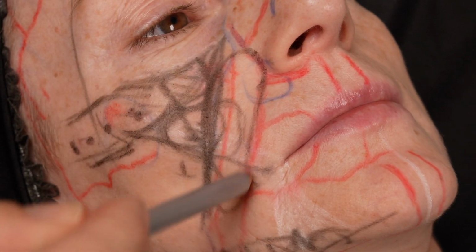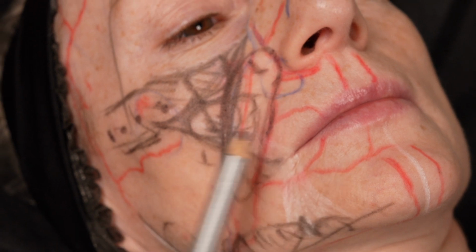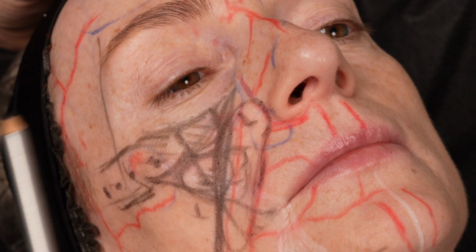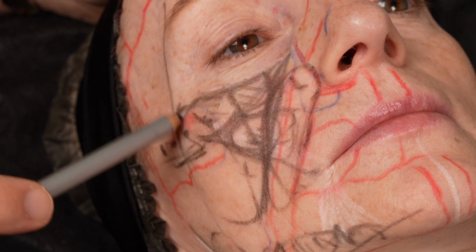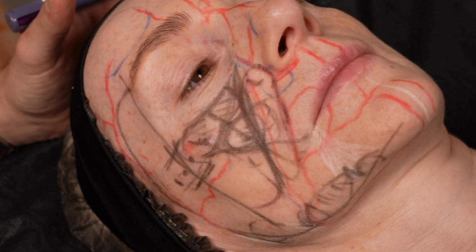This is the limit of the nasolabial fat pad. Usually it's also increased by aging, but not for her. That's why usually in superficial fat injections we do not inject the nasolabial fat tissue. Above this line, this is the medial, middle and lateral temporal superficial fat. You can inject it with your superficial fat injections with cannula.